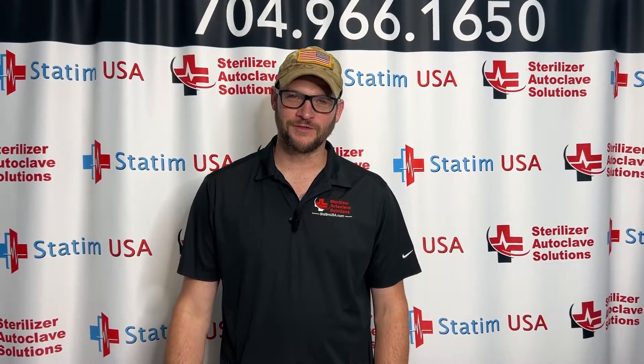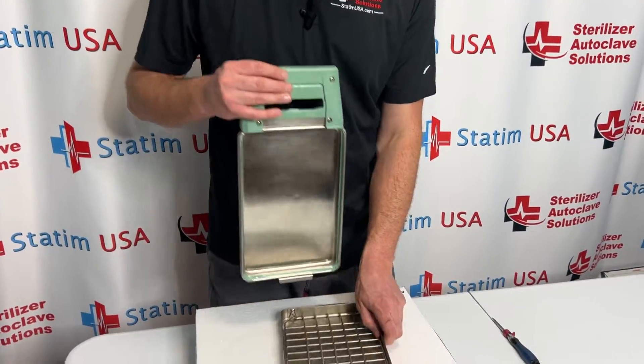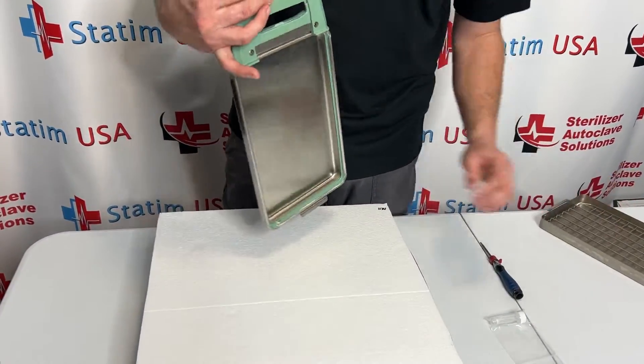Hi, this is Ian with Sterilizer Autoclave Solutions. Today we are going to be changing the cassette seal for a Statim 2000. First thing we're going to do is separate the top from the bottom and set the bottom off to the side.